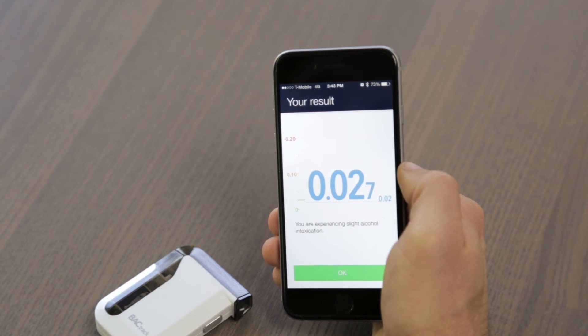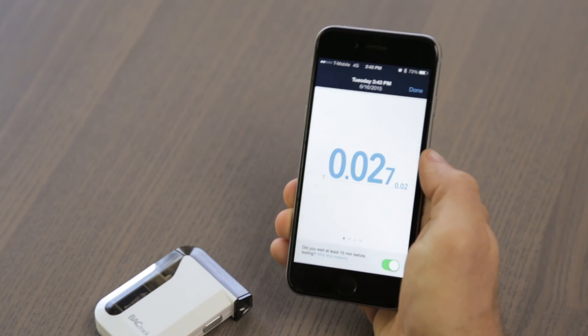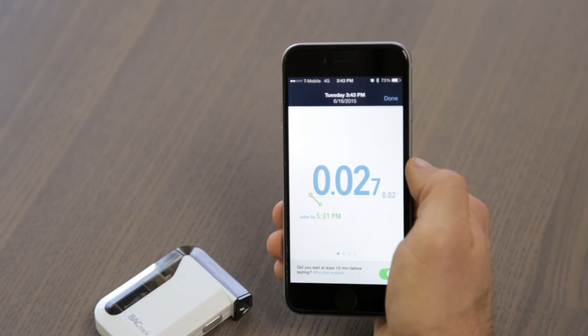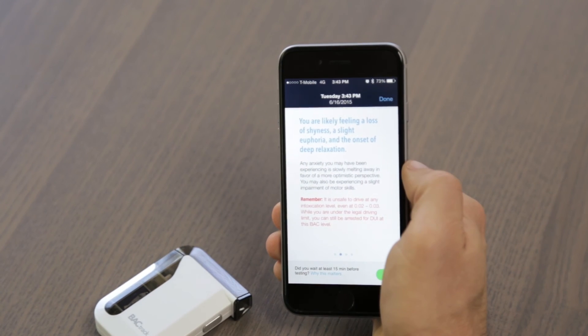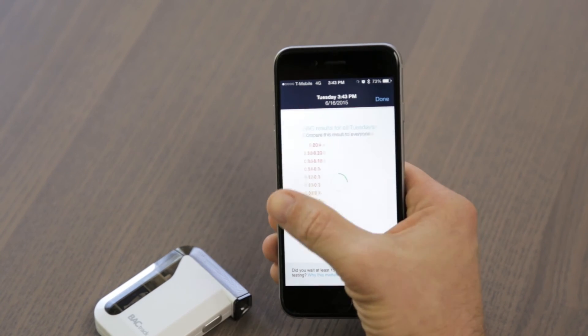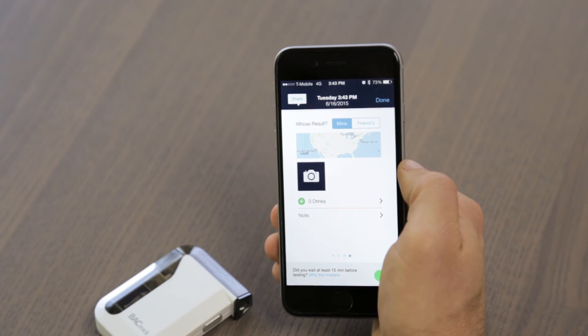Your BAC results are delivered on the next screen, along with a short summary of how alcohol is likely affecting you at this point. After clicking OK, the next screen shows your zero line — an estimate of when your BAC will return to zero. You can swipe right through three additional screens, which give you more information about your BAC level, your past BAC results, as well as an option to add drink notes and photos.